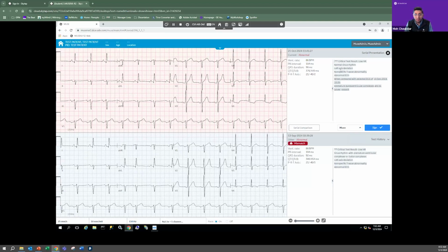So for that one, we require a more complicated solution, because for third-party non-GE cards, we do not have visibility into their algorithm to bring it in and say this is how it is going to be done. So it's something we're working on, but it certainly requires a more complex solution than what we can do with our GE cards.